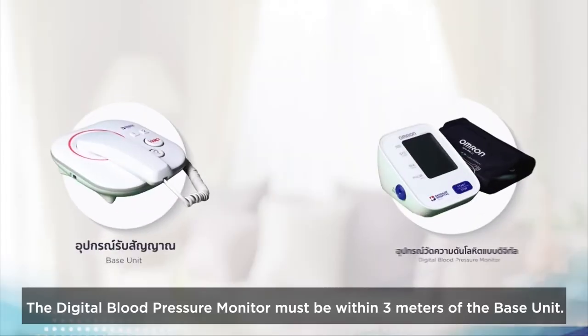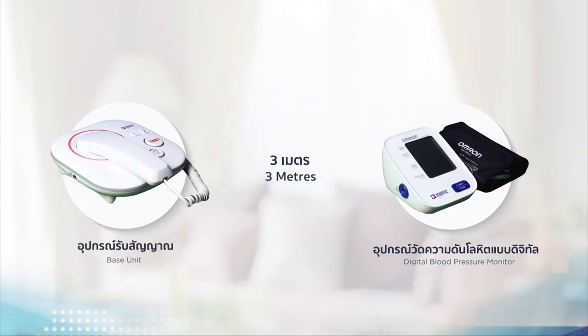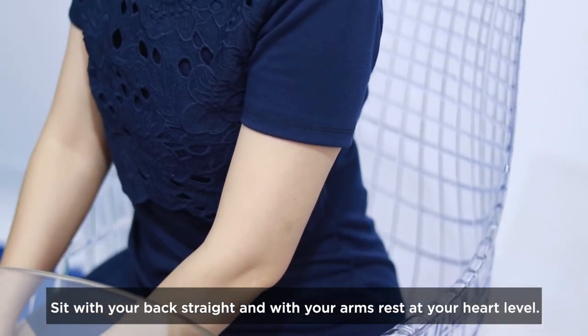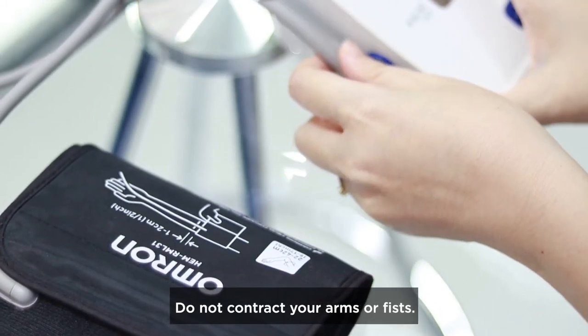The digital blood pressure monitor must be within 3 meters of the base unit. Sit with your back straight and with your arms resting at your heart level. Do not contract your arms or fists.